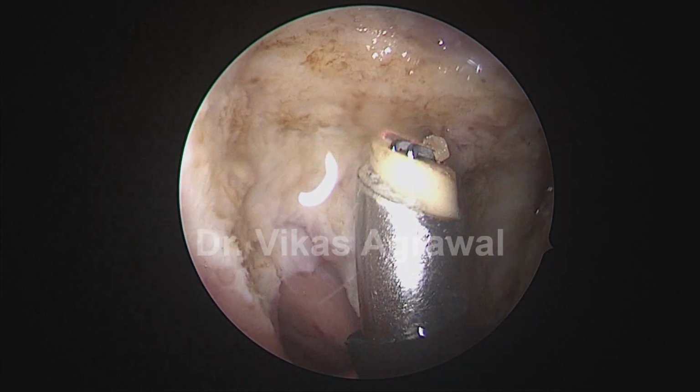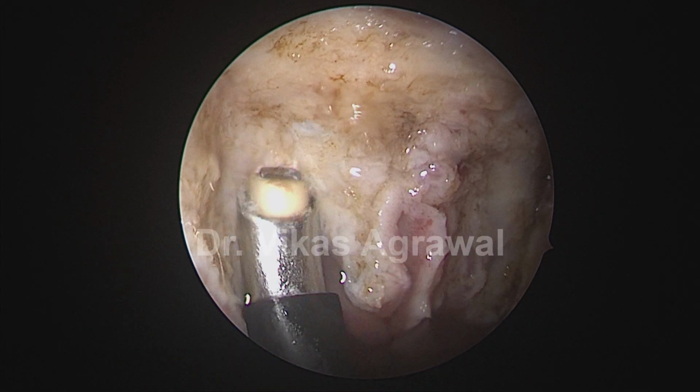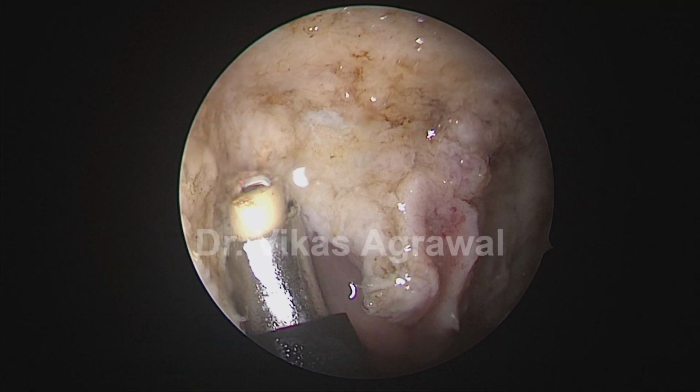That's the fossa of Rosenmuller. That's the posterior boundary, the buccopharyngeal fascia. You can see things very, very clearly if you have a good endoscopic camera or vision.